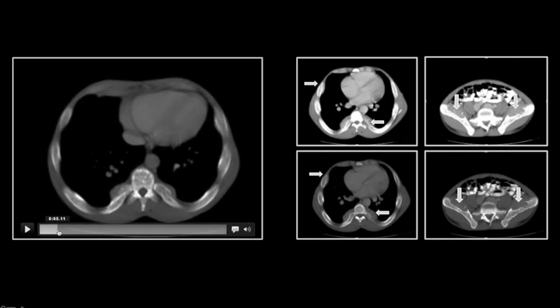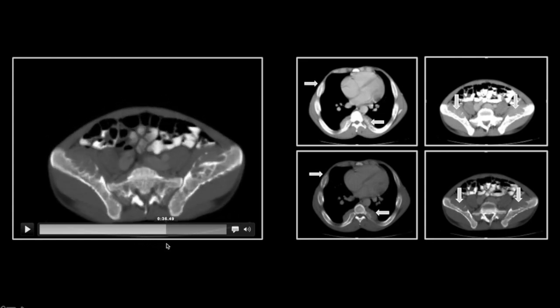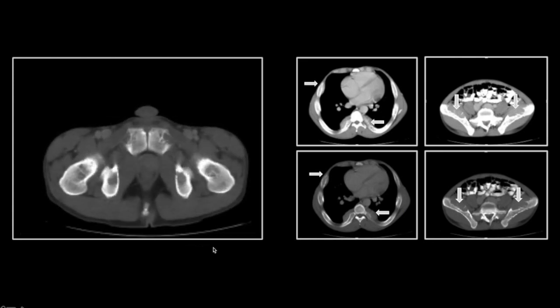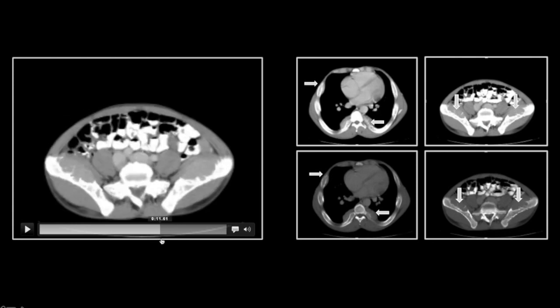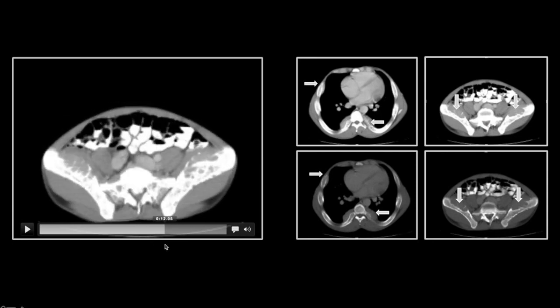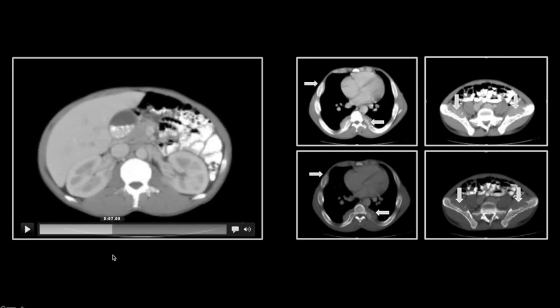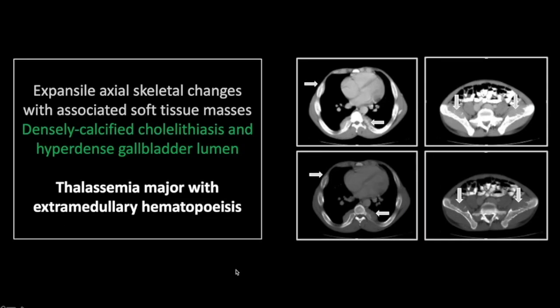So here are those skeletal changes — note again the expansion, most notable in the pelvis, involving all of the visualized skeletal structures. Again the soft tissue masses adjacent to the ribs and in the iliacs. And then those gallstones, varied in size, densely calcified, and with layering milk of calcium. So that is a case of thalassemia with extramedullary hematopoiesis and erythrocyte turnover resulting in bilirubin gallstones.